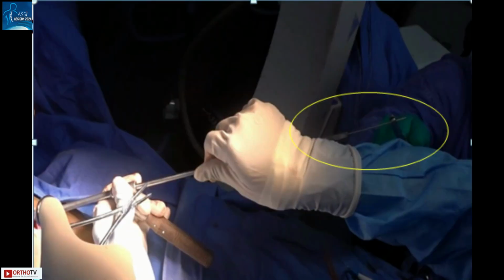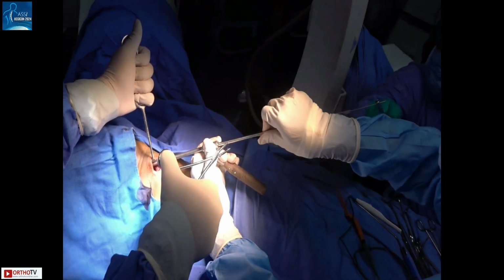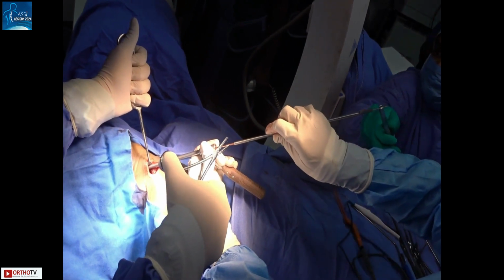As you can see in the AP view, the guide wire is passed to an adequate distance. And we have found it's always better that you use your hand to derotate it anti-clockwise rather than using the power instrument. If you use a power instrument, there is a more likely chance the guide wire may back out. And I would say this is one of the most important crucial steps. The most important step, I would say, is to achieve reduction and be able to get a good image in the image intensifier.